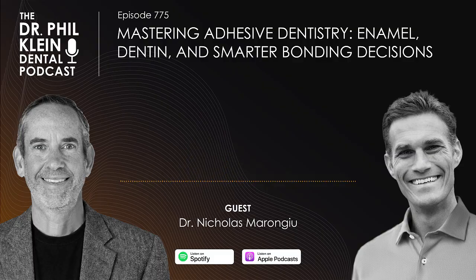Even with the dual cure, hitting each side of the surface of the restoration for 10 seconds after the dual cure component, for us, has provided that peace of mind, that extra little bit, knowing that the resins are fully cured. Because of the chemical cure in the deep areas where the light's not going to penetrate fully, but then hitting the other areas, especially the marginal areas, ensures that we get that full polymerization and we're going to get a great seal.